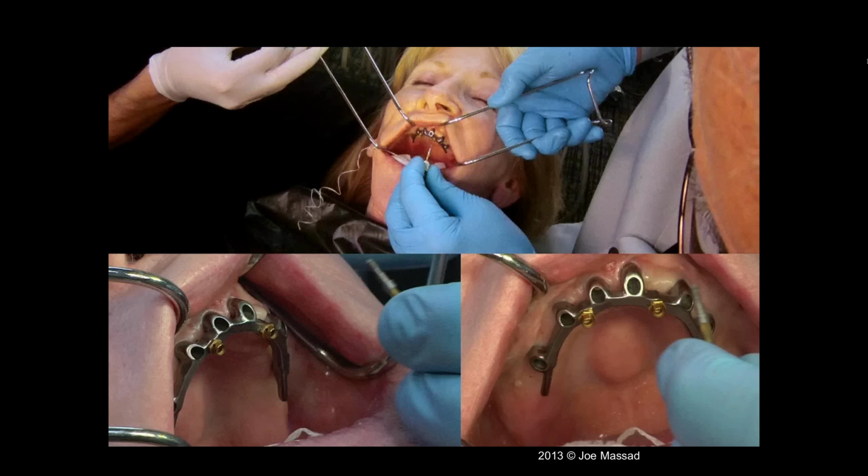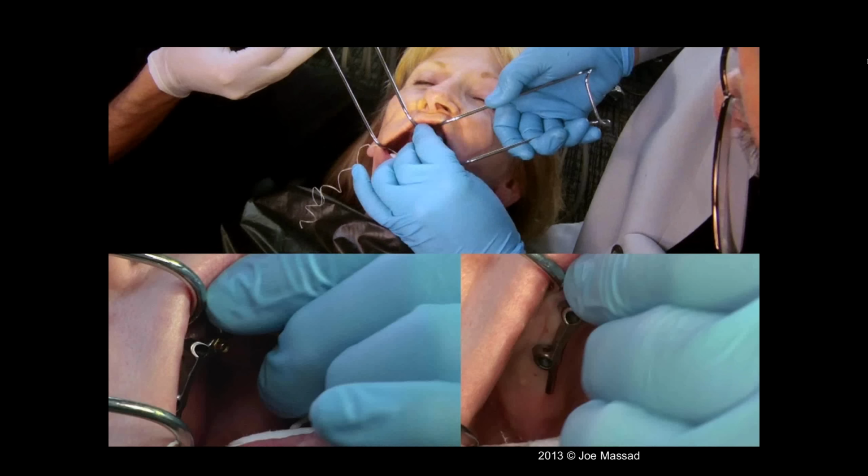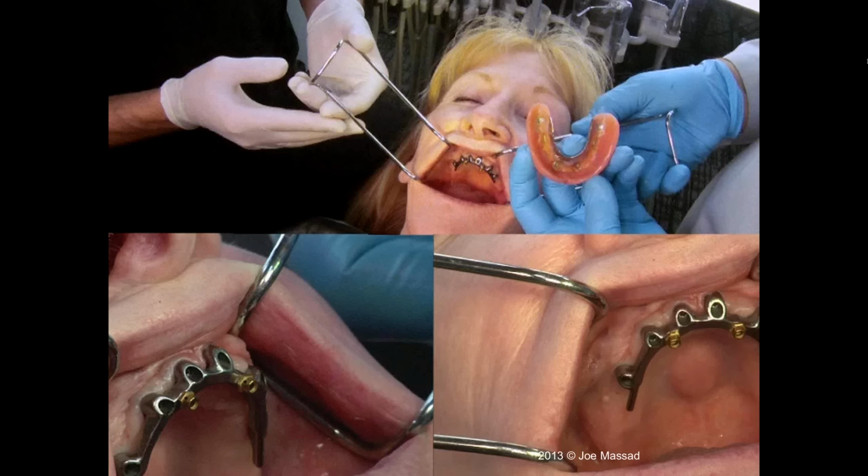So when we completed both bars and the prosthesis was processed, we went ahead and delivered it all on the same day. You say, why? We needed a cameo surface to support the face. This patient had a really sunken-in face, a smoker for many, many years. So we were able to make an accurate cameo impression and use the filled inside. And that then affected the appearance of the outside of the face.